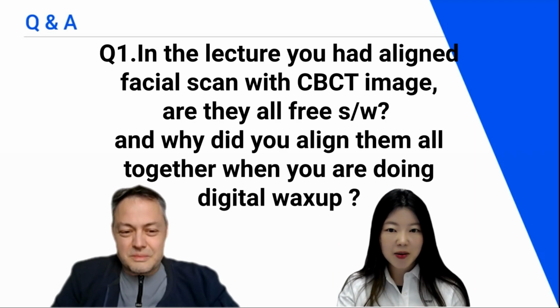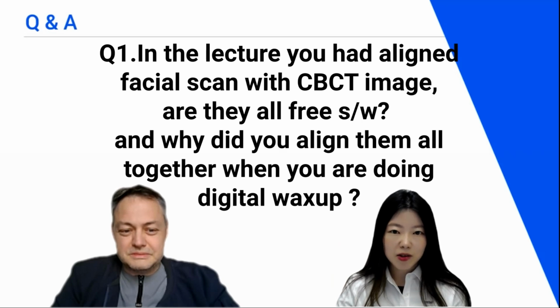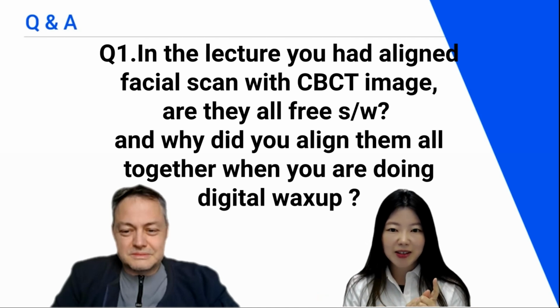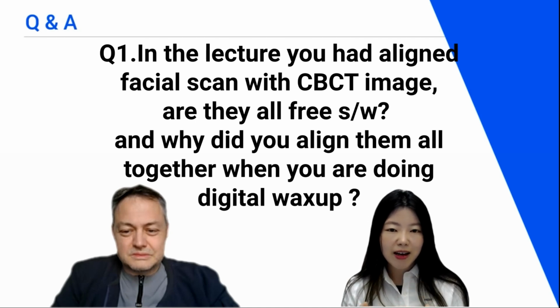Maybe let's talk about the Q&A session now. So we have 3 questions in total. And the first question is just my personal asking in your lecture. In the lecture, you had just aligned facial scan with CBCT image. So are they all free software? And I also want to ask one more thing. Why did you align them all together when you're doing digital wax-up?